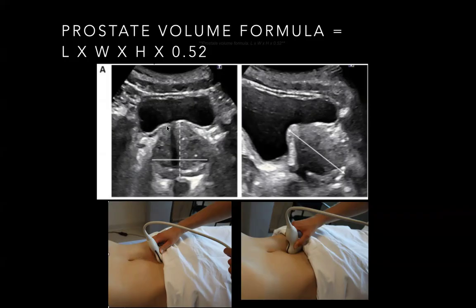And so just like for the bladder, for the prostate, you're also doing the same thing. It's really the same concept. With the horizontal transverse view, you are getting two calipers, left and right, up and down, to measure the two dimensions of the prostate. And then on the longitudinal axis, with the probe marker facing the patient's head, you are getting the longest diagonal from up to down. Okay. And anything greater than 30 milliliters is considered an enlarged prostate.